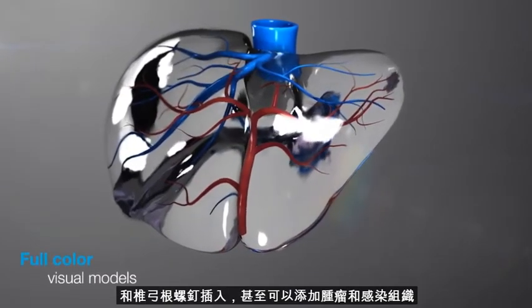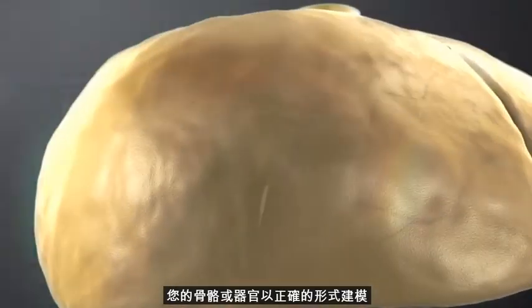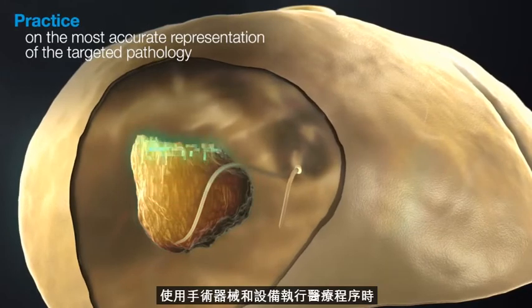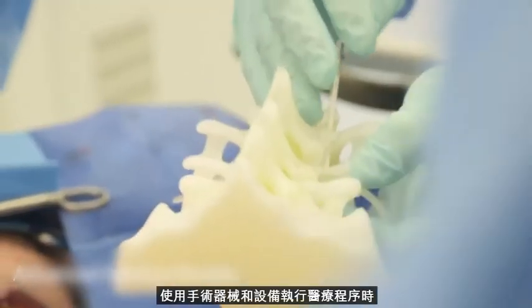Even tumors and infected tissues can be added to your bone or organ models in their accurate form, so healthcare professionals can experience the same tactile feedback when performing medical procedures with surgical instruments and devices.